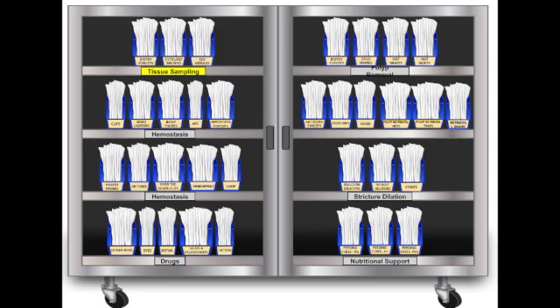Anchoring and marking. You can use clips to anchor feeding tubes in place or to prevent stents from migrating. They're vital for marking tumor sites for radiation oncology, so the beam can be targeted precisely. Exactly. Or even for interventional radiology to guide coiling or glue placement. And a clever trick during difficult ERCPs, sometimes a fold of tissue is in the way of the bile duct opening. You can actually place a clip on the fold and use it to gently pull the fold aside. That's quite inventive.